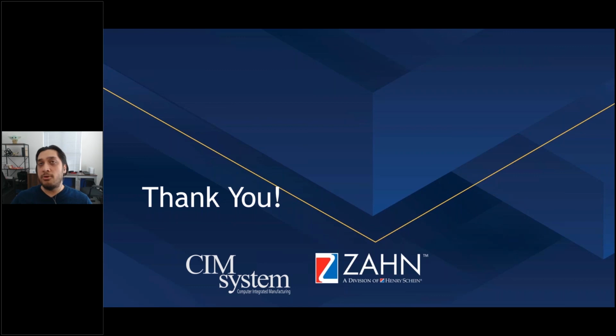So right now is the best time to upgrade, whether you're a customer that has MillBox and you're just on an old version, or a customer that has exocad and you've been waiting to upgrade to MillBox for whatever reason. There's never been a better time to upgrade than today. So certainly that's a good question, and I'd say call your rep and talk to them. In the short term, that answer may be a lot less than you think.